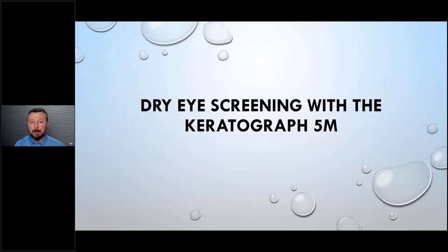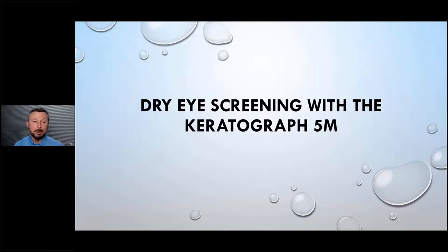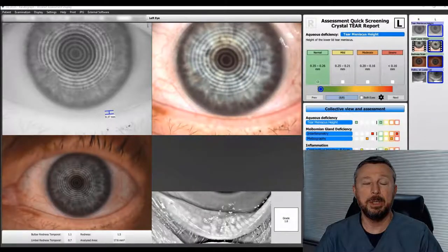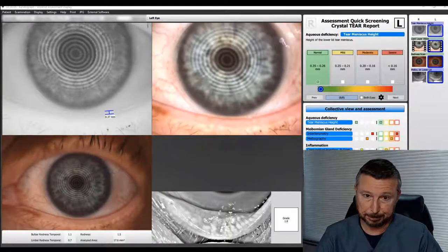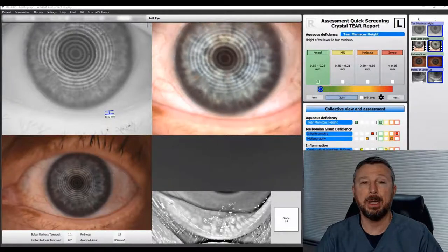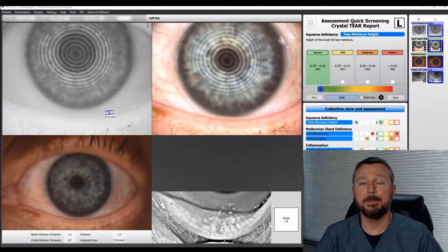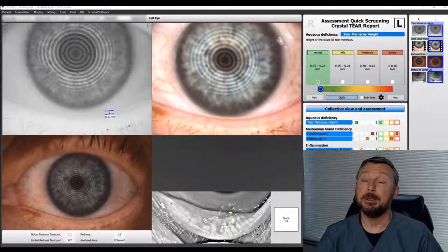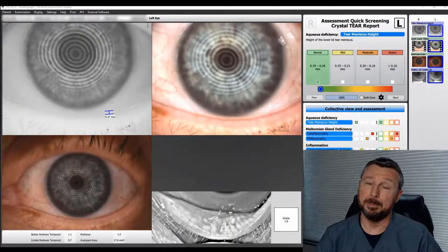I'm going to play a video showing exactly how I use the Keratograph 5M for screening. The video may come out a little choppy, but it will be repaired in the recording. We screen absolutely every single comprehensive eye exam patient as part of our normal routine. There is no additional charge for this screening, but we screen every single adult over the age of 18, and children under 18 if they're symptomatic.